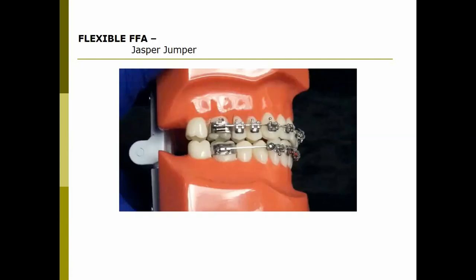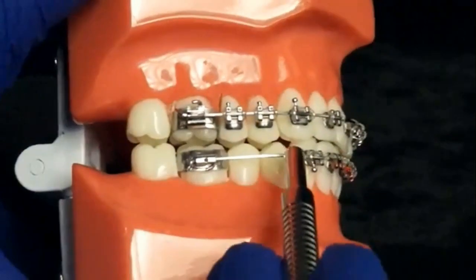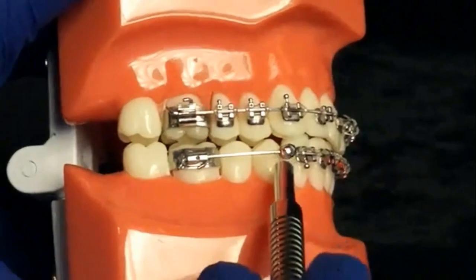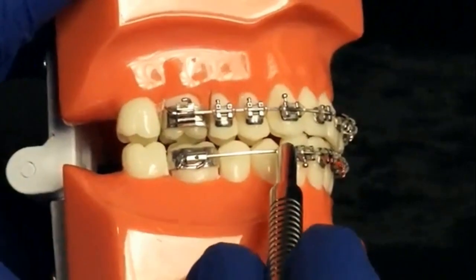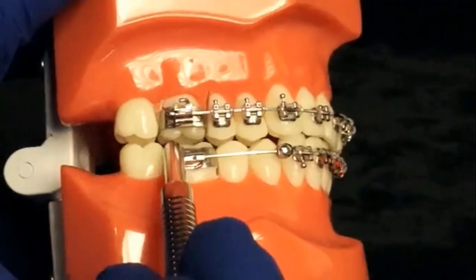So the flexible ones will be which are a little flexible, they are fixed. So you can actually do it with your braces treatment happening. So they are fixed and you cannot remove it yourself, but the material used is very flexible. It's like a spring which is there in a nylon, a rubber-like material. So this is how we are deciding the length in detail. There'll be a lecture later. I just want you to have an overview of what it means.